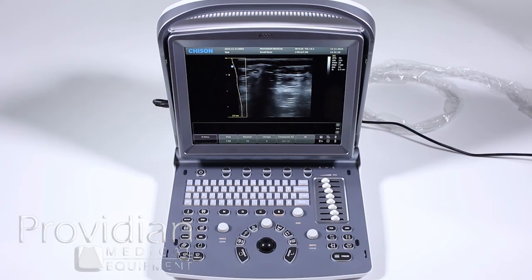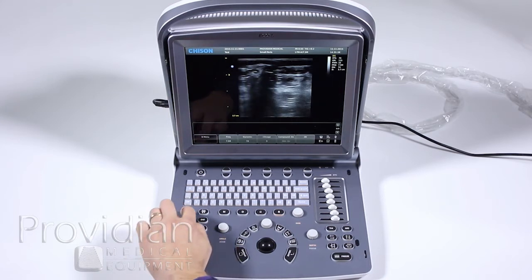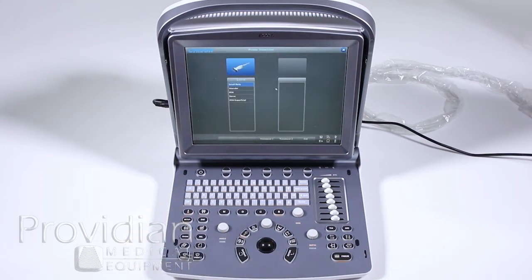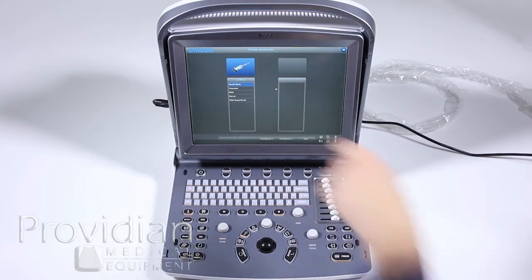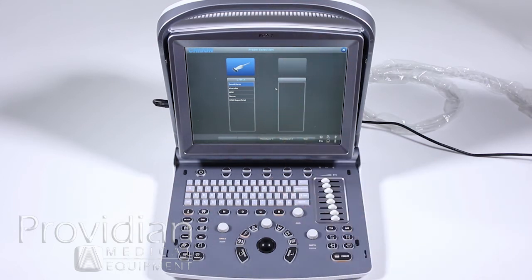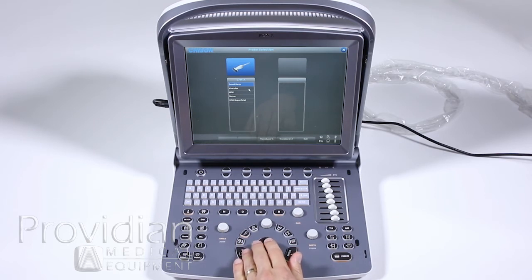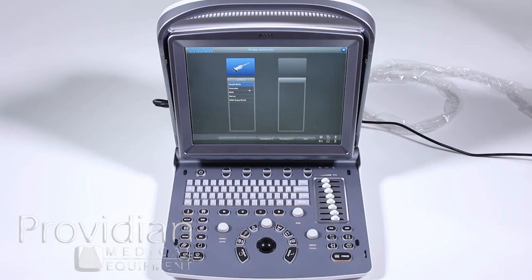Now we want to select our probe. If two probes are plugged in, both will be highlighted. With one probe, you get a selection of presets for imaging, annotations, and the measurement and analysis package. When you select a preset, the image is optimized for that application. When you hit the calcs button, it pulls up calculations specific to that modality, and the annotations library is associated with it as well.